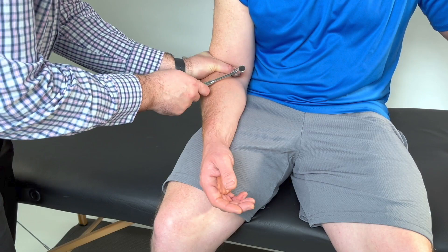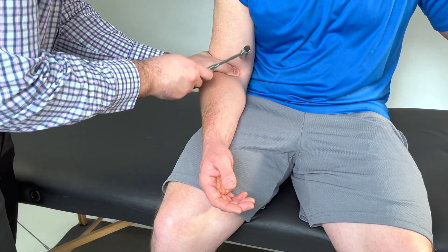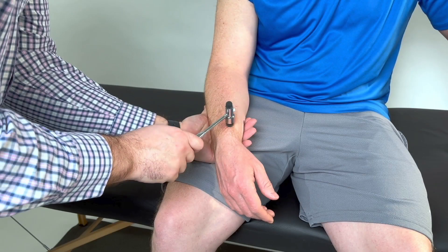For the biceps, make sure their arm is completely relaxed and place your thumb over the tendon and strike your thumb. For the brachioradialis, have the patient's arm in a neutral position and watch the wrist for movement when you strike with the hammer.